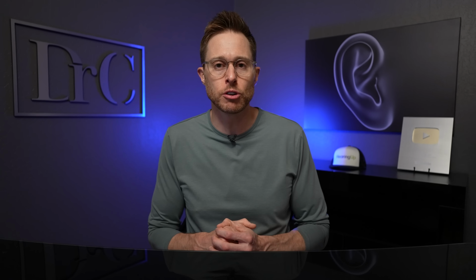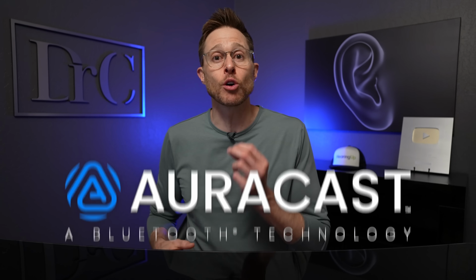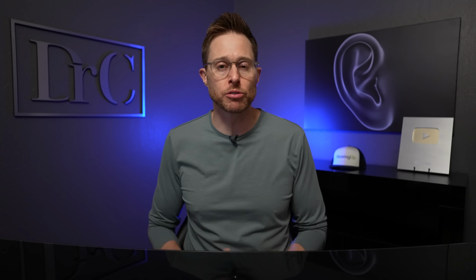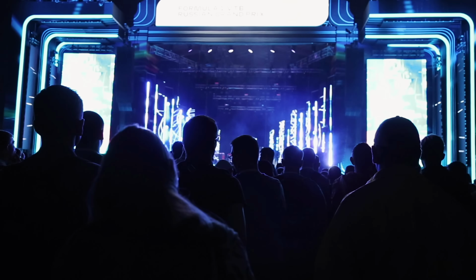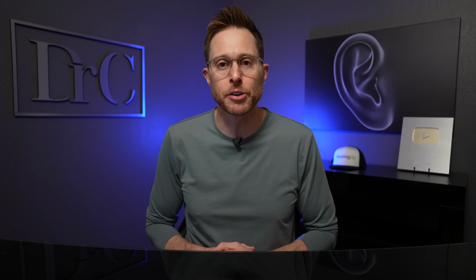When LE Audio does become more widely available, they can do this firmware update really whenever they want to, which would give you better audio streaming quality, lower the battery drain, and it will even give you access to Auracast broadcast audio. Auracast will essentially give you access to audio in public venues like churches, museums, sports bars, or even concert halls, meaning that you'll be able to stream the audio from those venues directly into both of your ears, and the sound quality will be amazing.